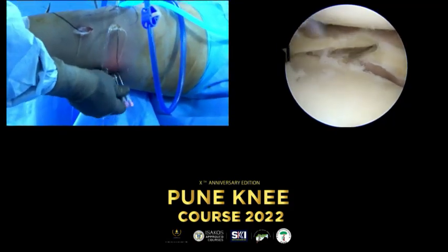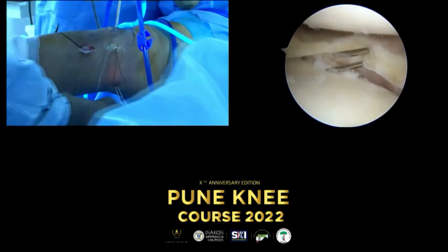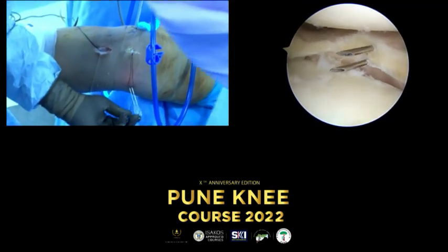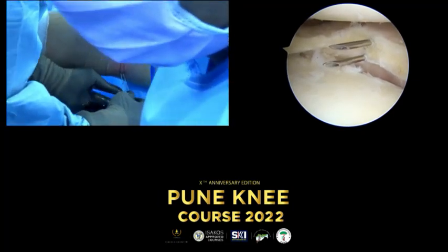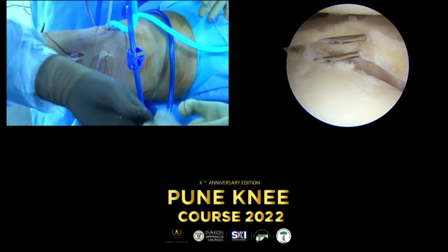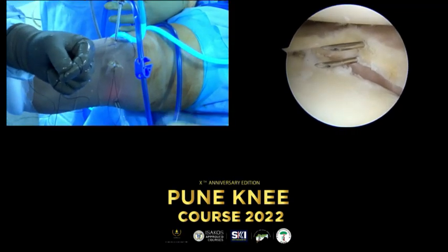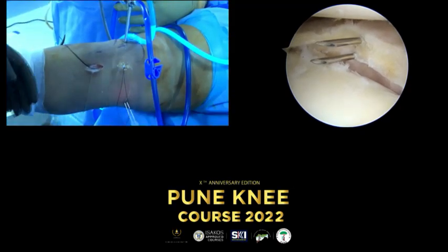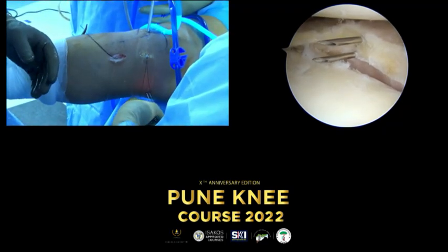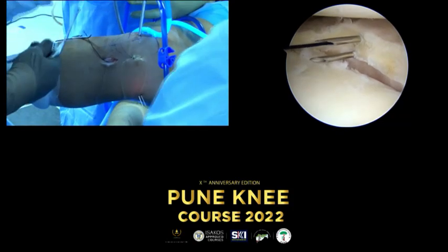Okay, now we need the lower one. We introduce the number one nylon or Prolene or whatever. Can you hold this? One is enough. Can you cut here? Right here, with a scissor? Yes. Can I have a grasper? I will put, okay, he's introducing. This here. Can you hold this? Thank you.